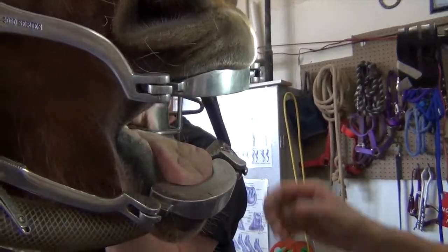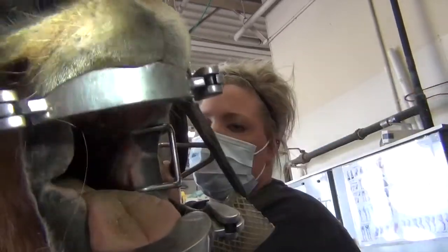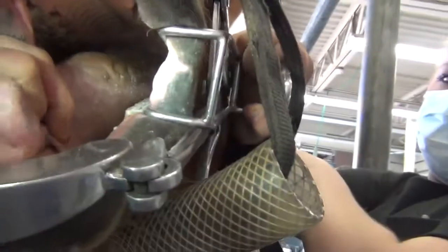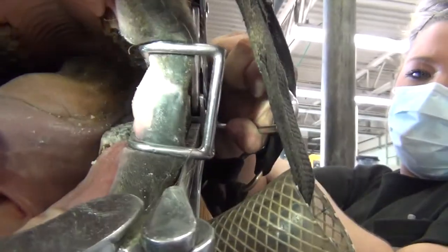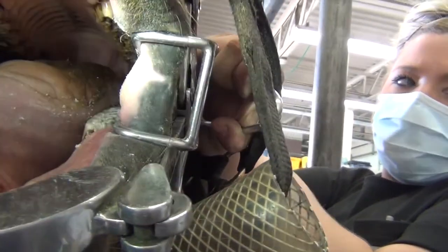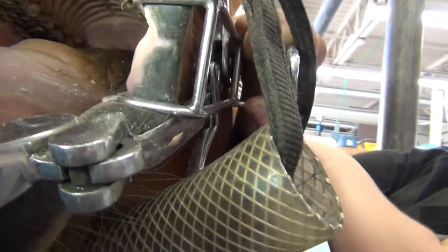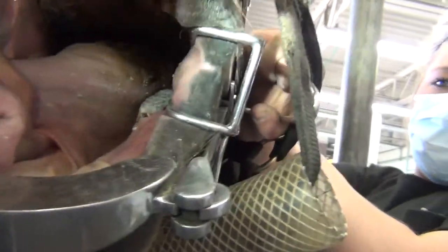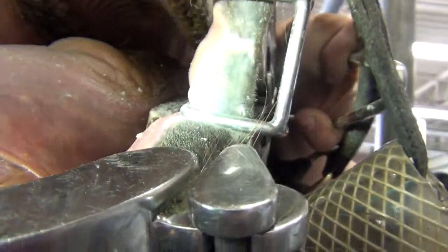And then we use this little instrument here. It's just a cheek retractor. Helps pull the cheek out of the way so that I can see better. Sharp rims that were on the upper corner of the tongue side of the lower cheek teeth. And also she had a little bit of a hook on the very last cheek tooth toward the back that I ground down. I think you can probably notice the difference if you look at the before and the after.